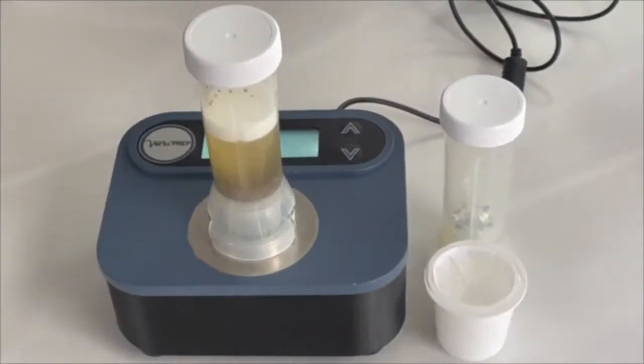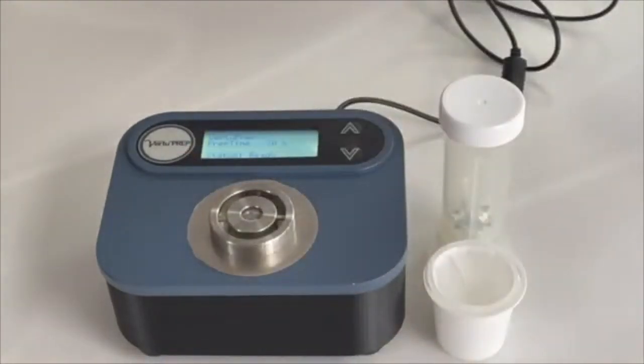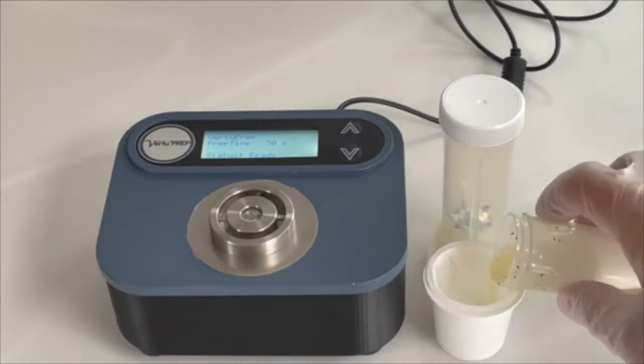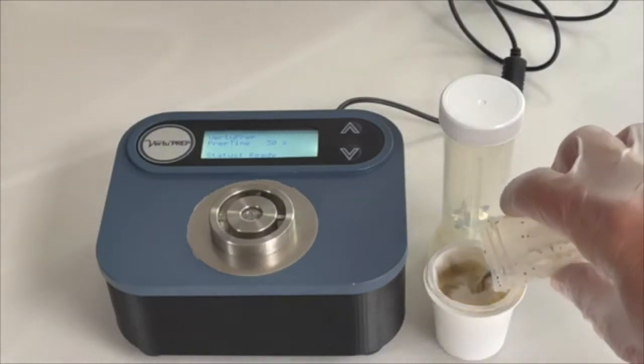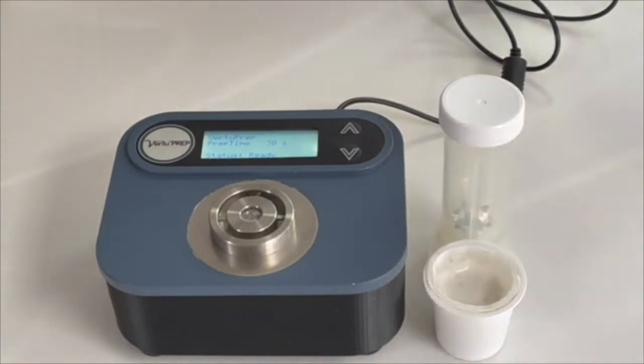Filter the extract into a clean two-part V filter cup for the time duration in the procedure being used. Dispose of the filter cups and you're now ready for your next sample.